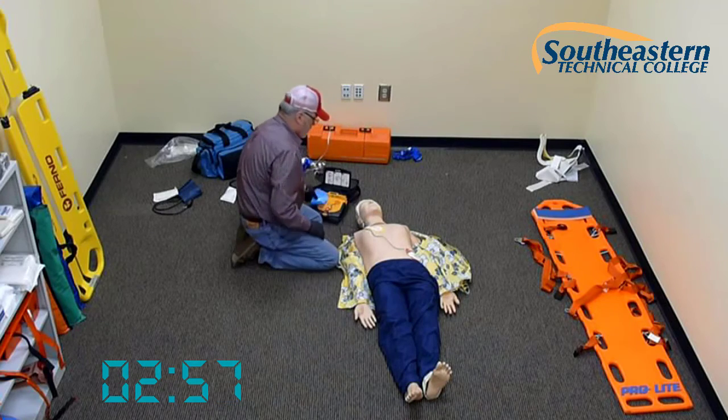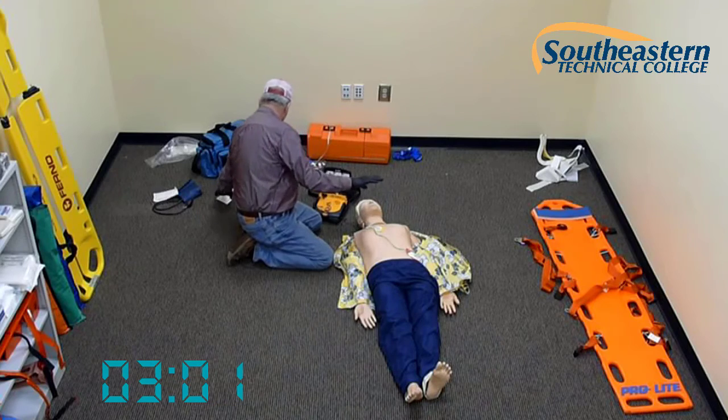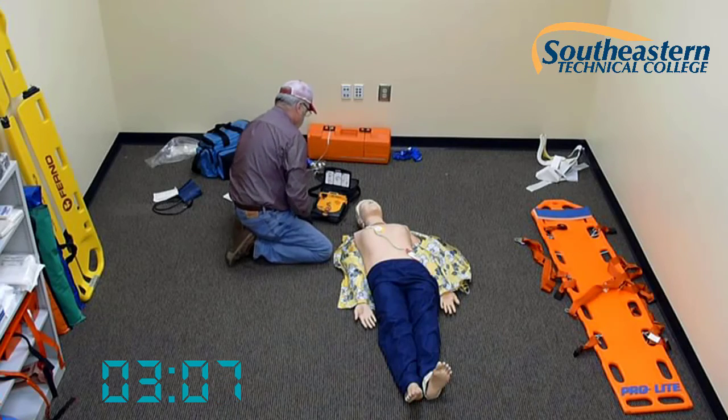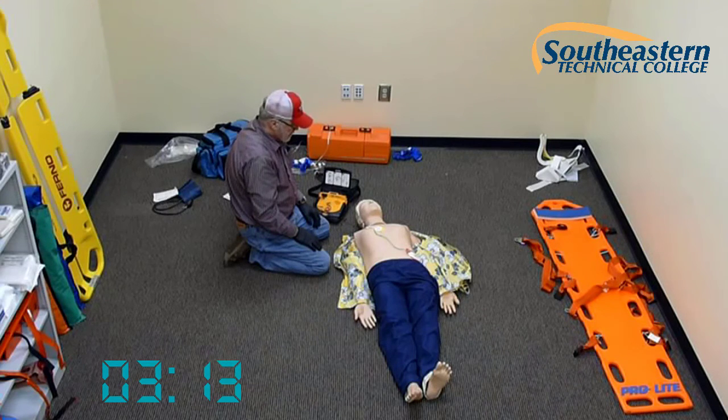Pads are in place. Pull red handle to open bag. Stop CPR. We want to look at pictures on pads. Do not touch the patient. Evaluating heart rhythm. Stand by. Preparing to shock.